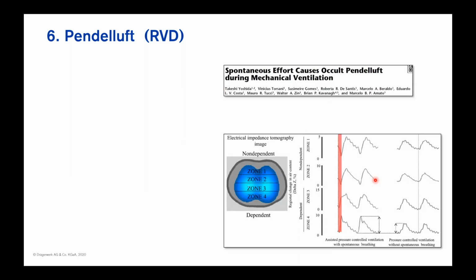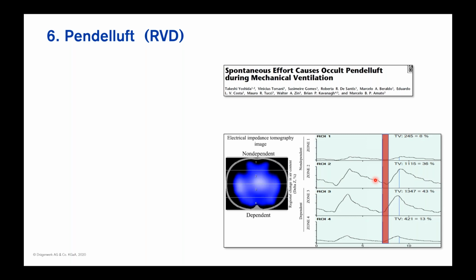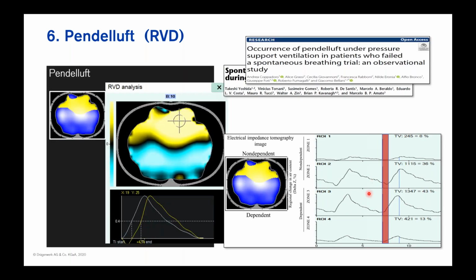Those effects have already been studied and described in various clinical studies that have been published. And again, this is another example of a pattern of how Pendelluft effects can be displayed and visualized with the EIT or with the regional ventilation delay.